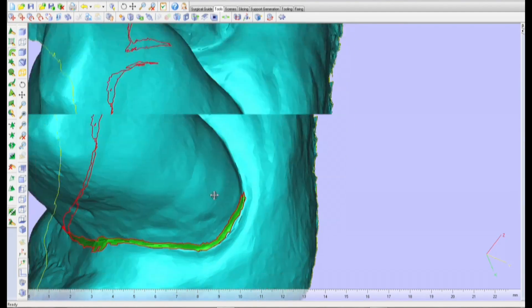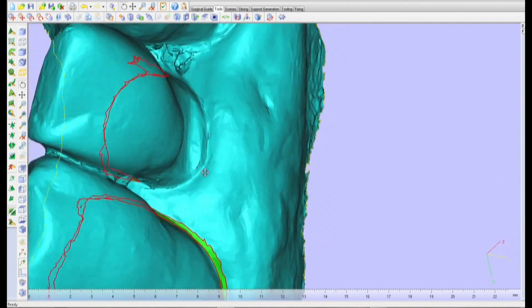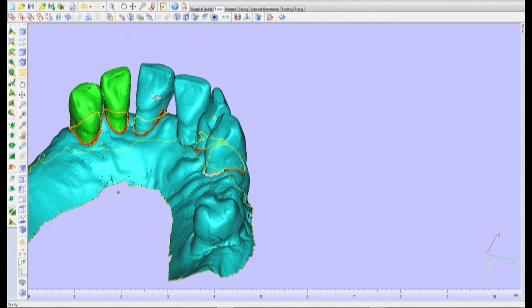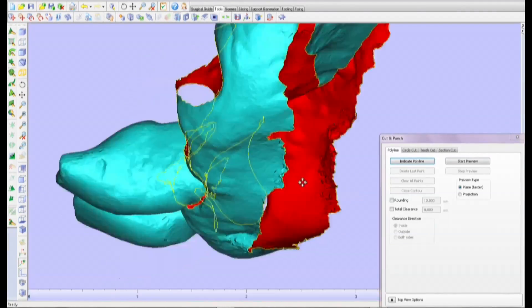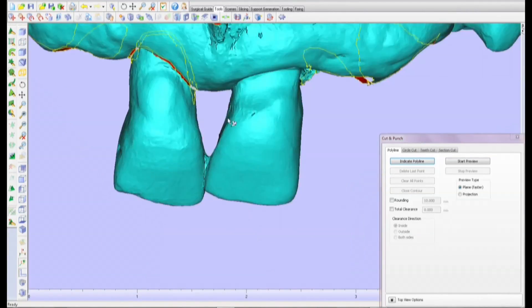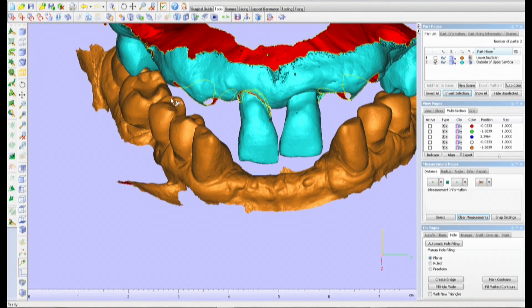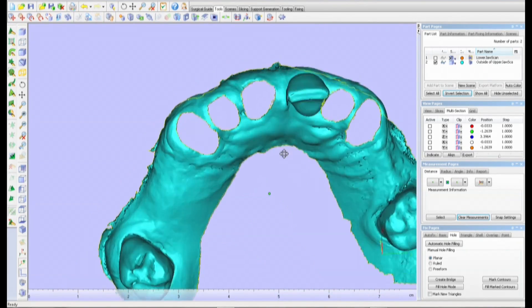The question is whether clinicians are comfortable with this type of procedure and a fully digital workflow. If not now, then definitely in the near future — this is the direction dentistry is going. Once we have all the information from the full arch scan, especially in the maxilla, we can export the data into a third-party CAD/CAM software where we can virtually extract the teeth.